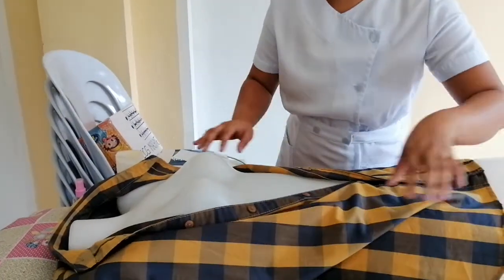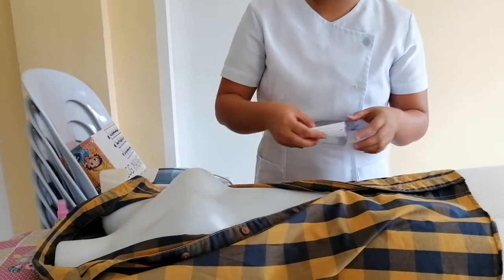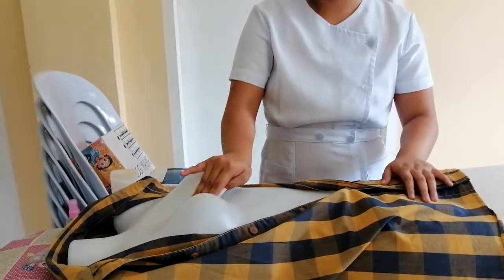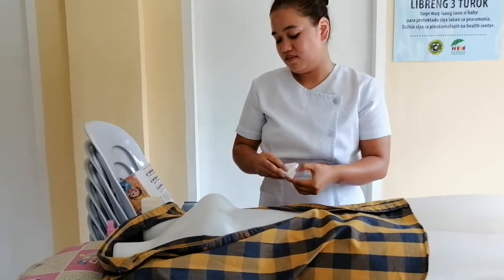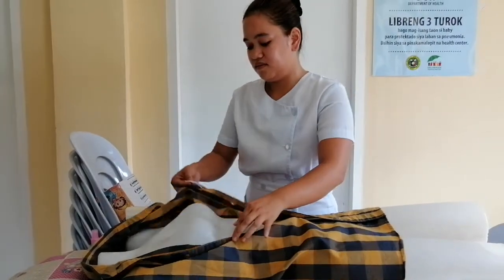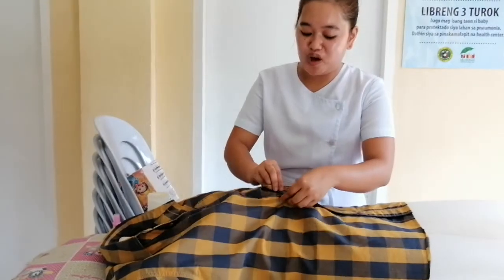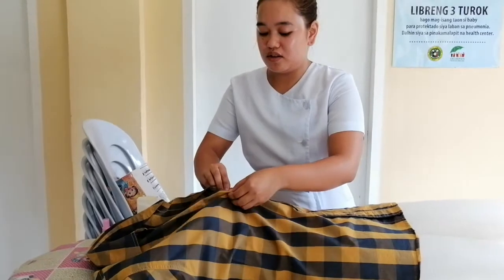After removing the leads on the chest, we need to wipe the excess electrogel on the chest of the patient. Then discard. Then we're now going to close the cloth of the patient.